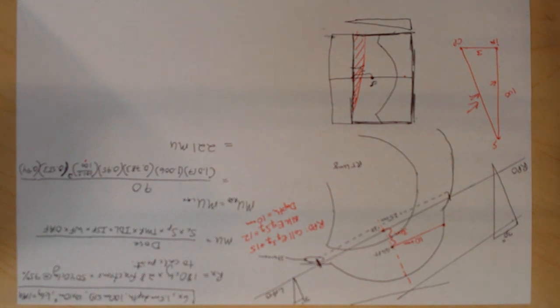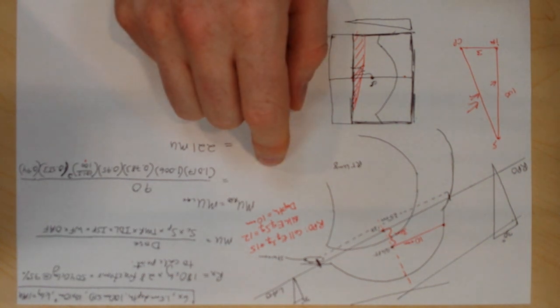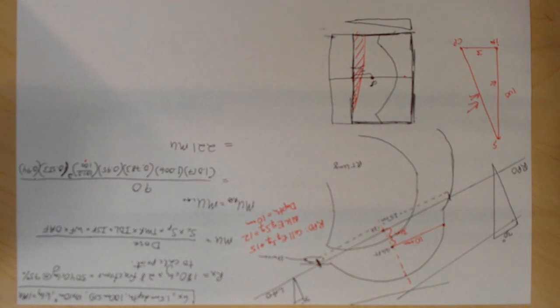The next thing I have to do is look up an off-axis factor, or off-axis ratio. And the off-axis ratio depends on energy, distance off-axis, depth, and it also is going to vary on the type of wedge that I have. So if you look in the data tables, I need a 30 degree, and we have them listed at 30 degree thin, 30 degree thick, and 30 degree non-wedged. Means, are you off-axis in the thin, the toe portion of the wedge? Are you off-axis in the thick portion of the wedge? Or are you off-axis in the non-wedged portion?